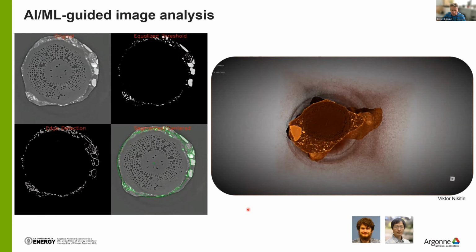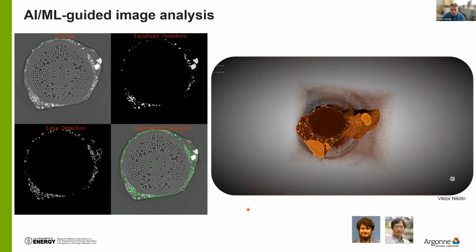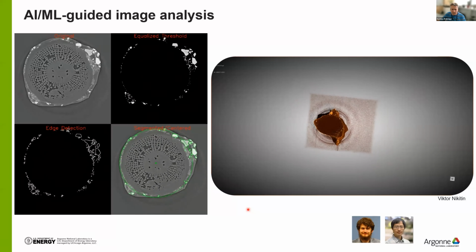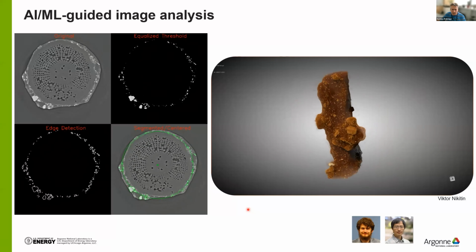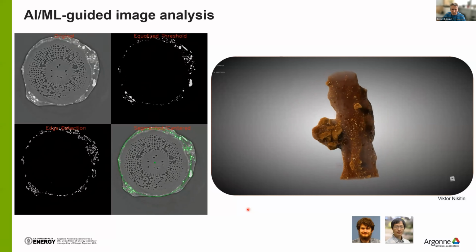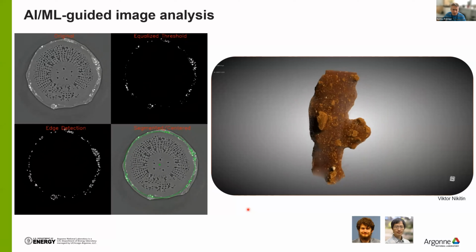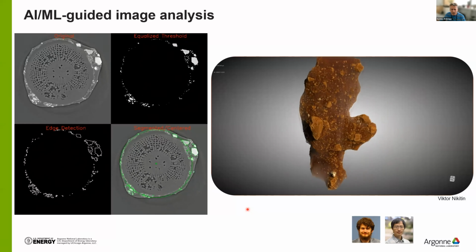They were able to use AI methods to figure out if one of those CT images actually contains information that there is a brain injury, without using MRI.